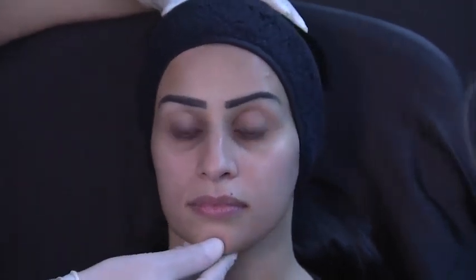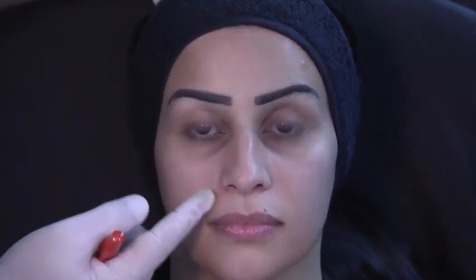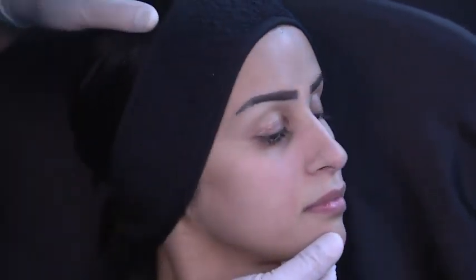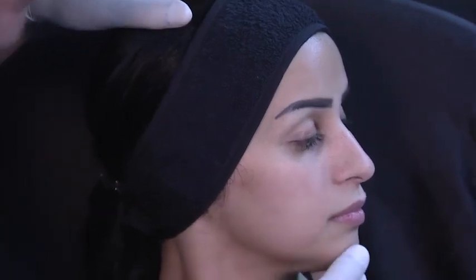So you could start explaining the new patient that you have here. Right, so this is the second kind of patient that I thought it was interesting for you to see, because she's also young. She also wants to improve her tear trough, and we know that to improve the tear trough, we need to treat the mid phase. But if we see her in profile, we don't see the volume loss that we saw before in the other patient. So this is a different kind of patient.